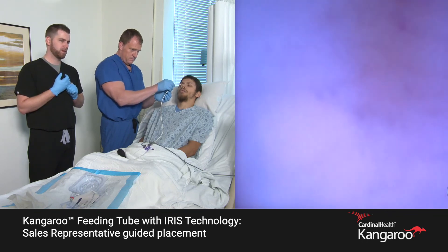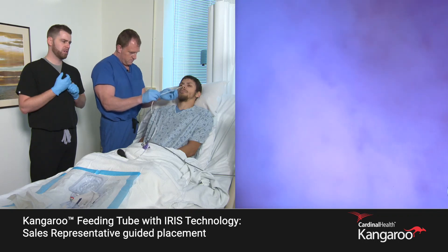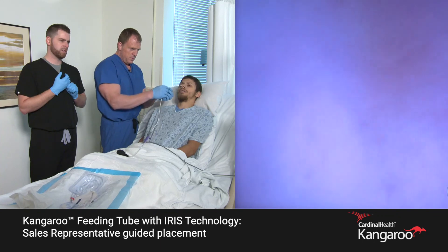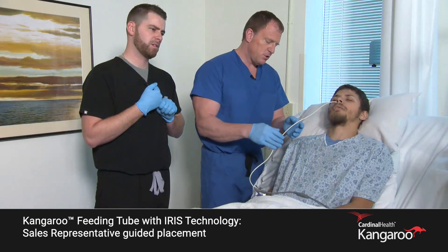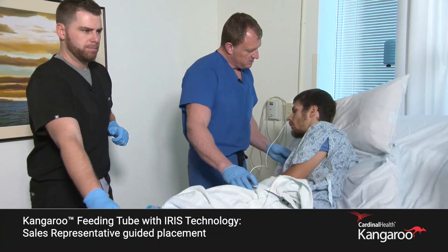What depth do you have? That's 75. Okay, let's slowly advance. Let me know if you meet any resistance. Feels like it's going back — we may have passed it. Let's try again. Turn onto your side, like you're sleeping on your side.